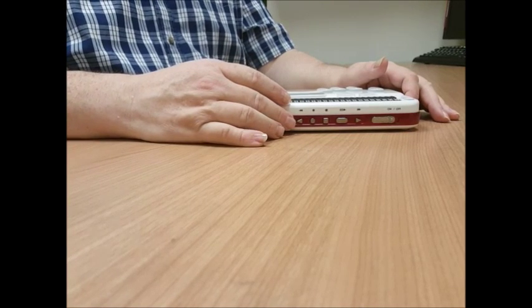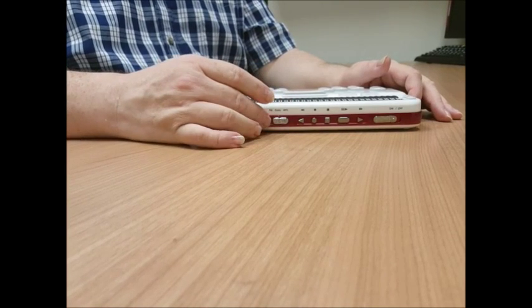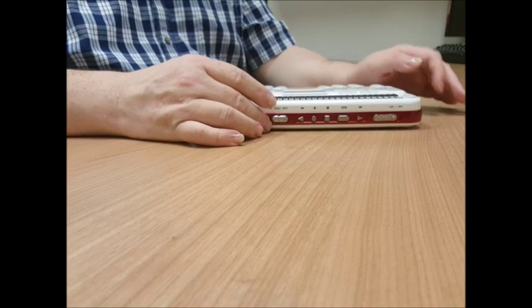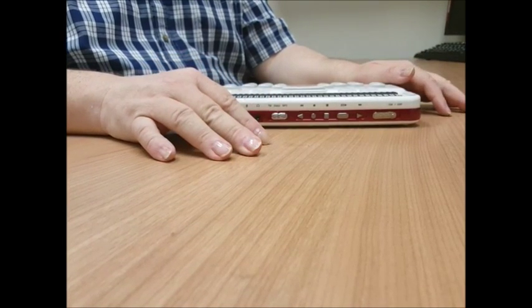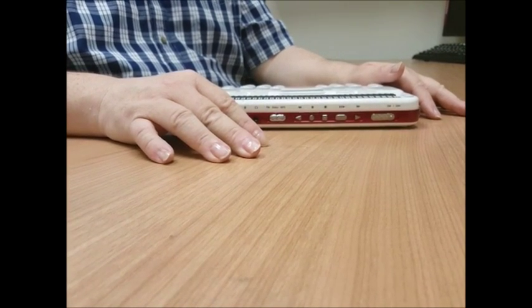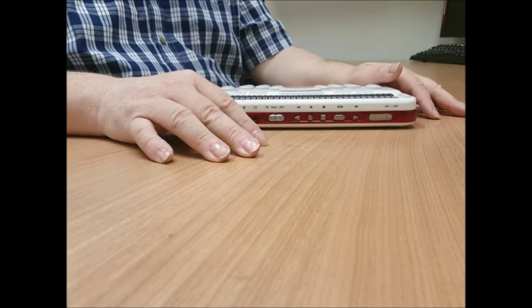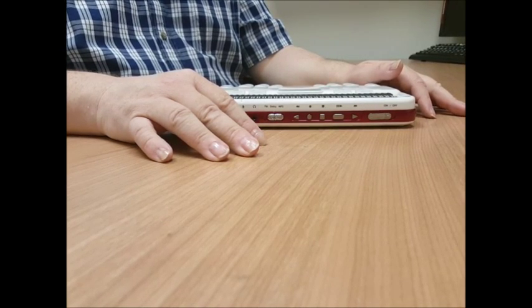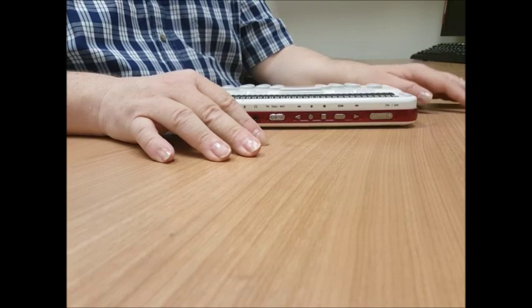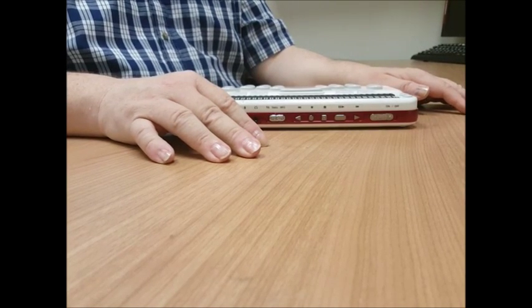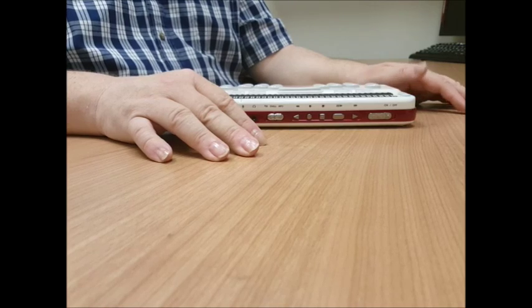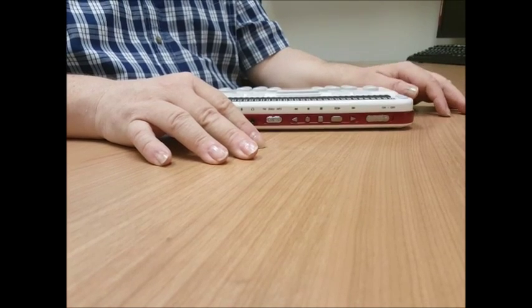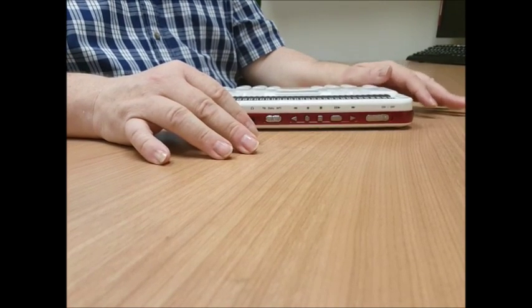Coming a little more to the left is the media mode selector that tells the unit what functions those media keys are going to be working on. For example, you could be playing music, and so then you'd want those keys to be doing music or the media player things. You might be reading a Daisy book, and so you would want those keys to work on the Daisy player. That's what that switch is for.